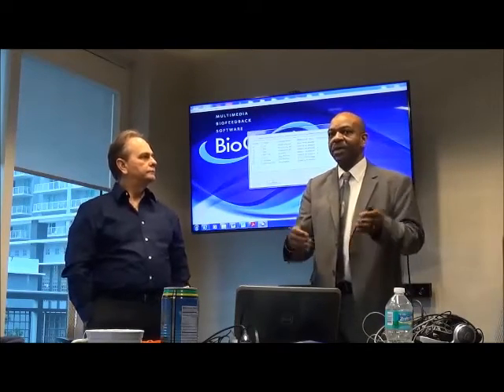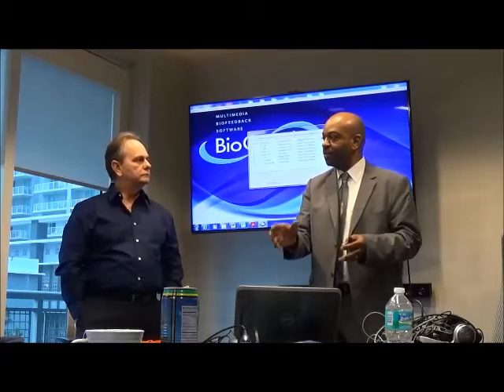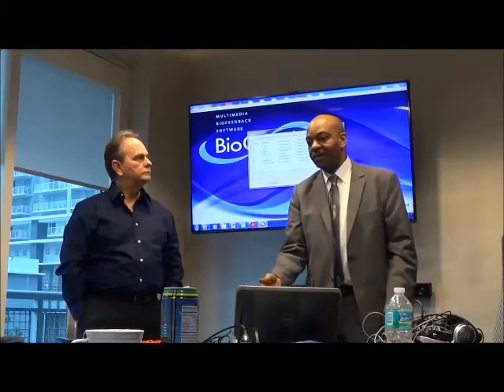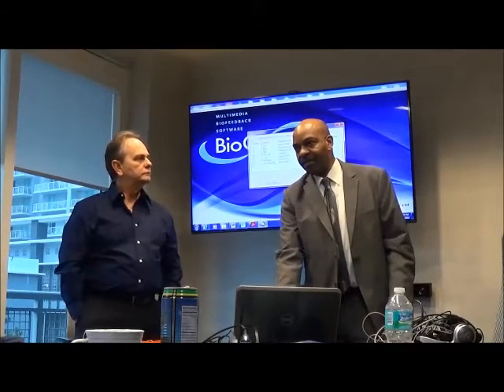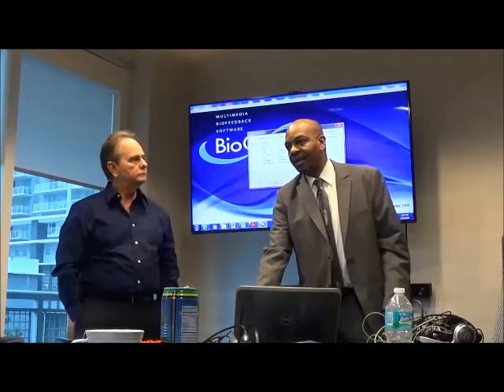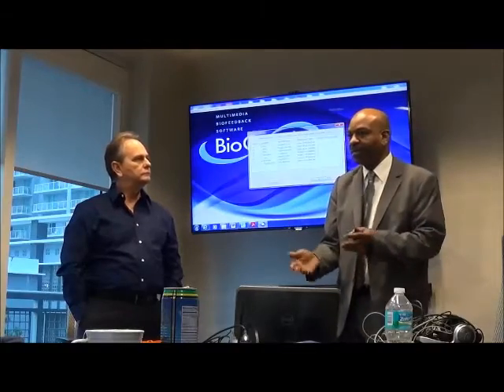So they had different people administering the test, but they followed the same script. If they were doing it manually, maybe somebody, instead of starting at exactly 2 minutes, might start at 2.5 minutes or 5 minutes or something. So that was a way to keep it the same.